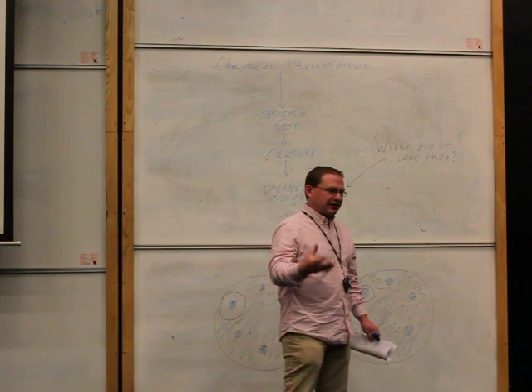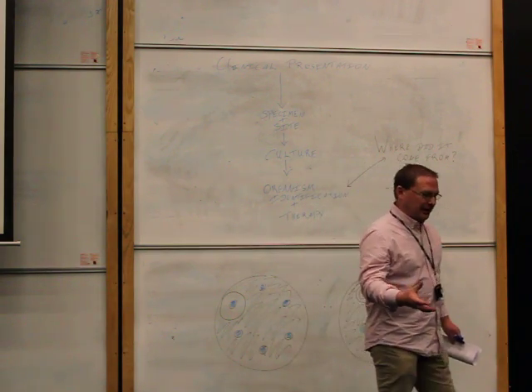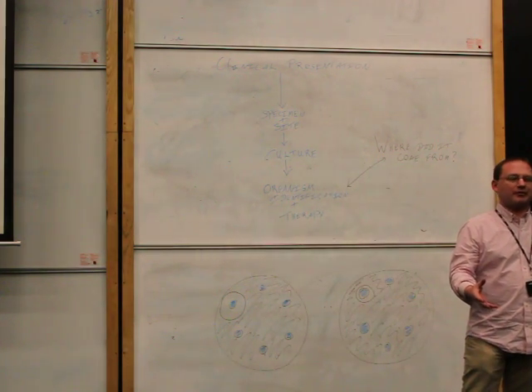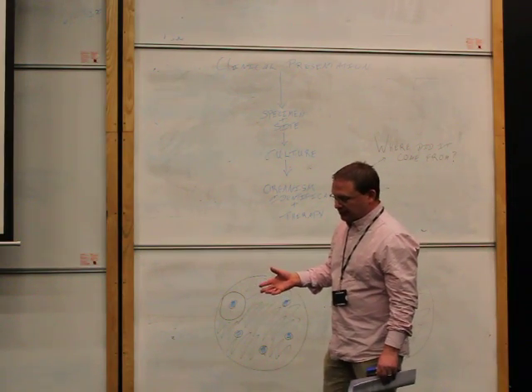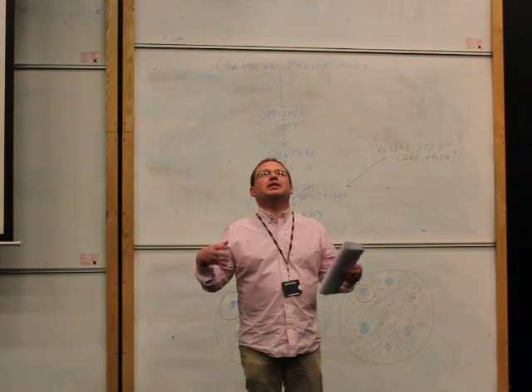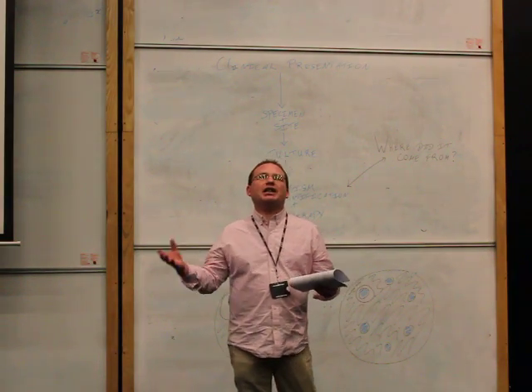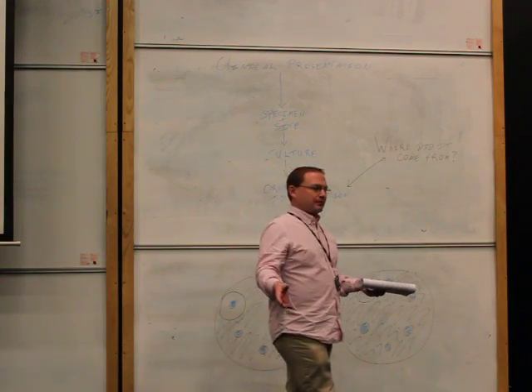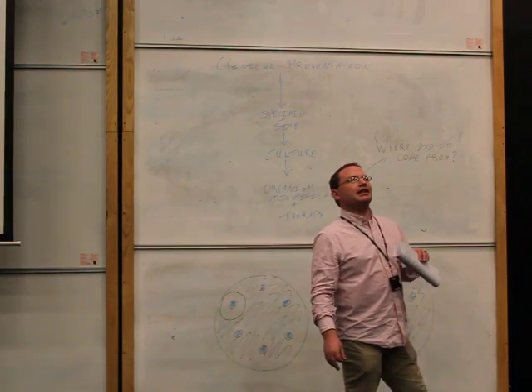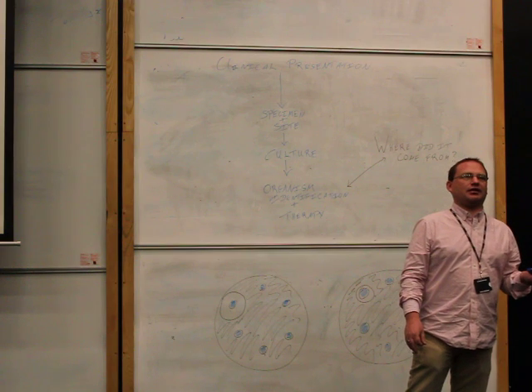It's very well documented, and I do believe it is in MIMS. So the doctors have an idea this is what's wrong with the baby, but they need to prove it. So they take swabs of the blisters, send them to the laboratory, and that is where we culture them. We culture them onto agar plates, various agar plates, and see what grows. Unsurprisingly, in this case, nothing grows.